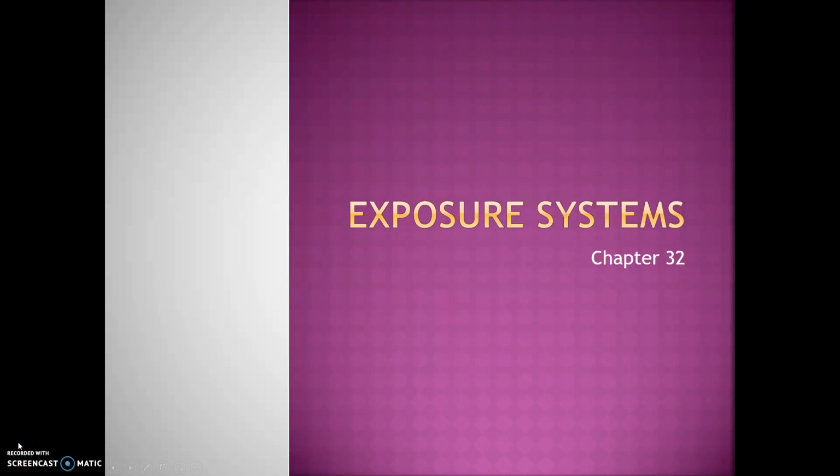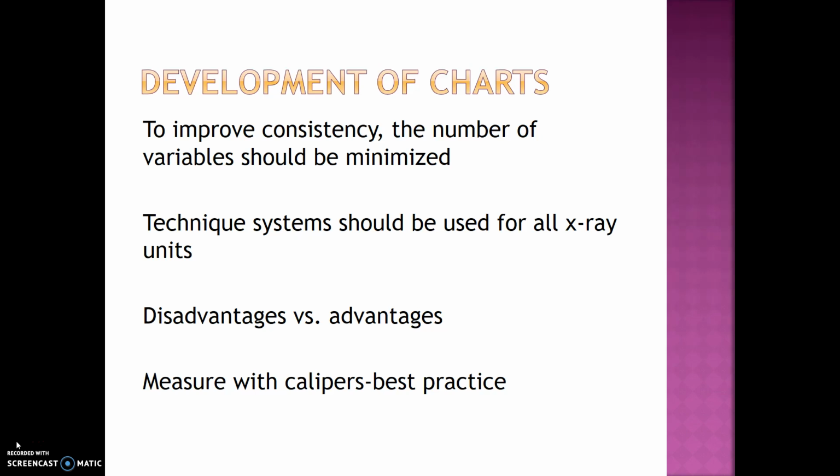Today's lecture will cover exposure systems. To improve consistency, the number of variables should be minimized. Technique systems should be used for all X-ray units, and it is best to measure with calipers for best practice.